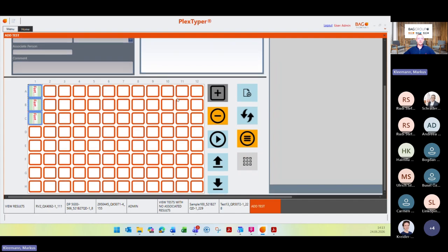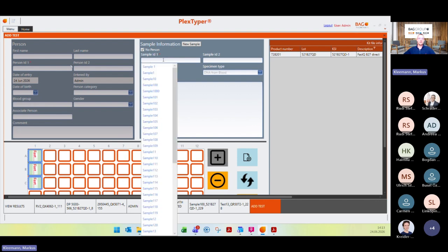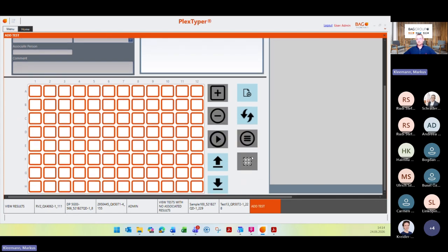So there are 2 options to do this more easily. One slight thing is that you can add a barcode scanner to your computer, scan the barcode of your sample tube, for example, and then the whole number appears here. This is one little option, but the main thing I want to figure out here is the Excel work list. So with these 2 buttons, you can create the Excel work list with this one here, and with this you can import this Excel work list. So I will do this now.